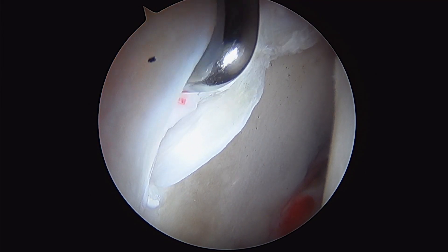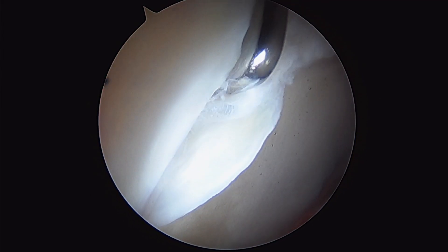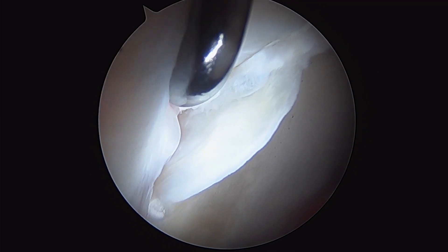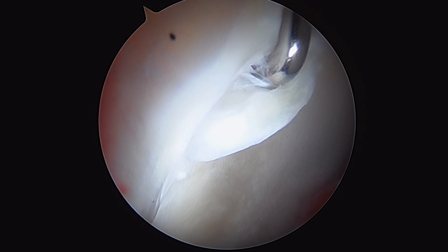This is just adjacent to where the labrum is torn. If I pick the labrum up and go underneath, you can sort of see exposed bone down in there, with the cartilage peeling away from the acetabulum.